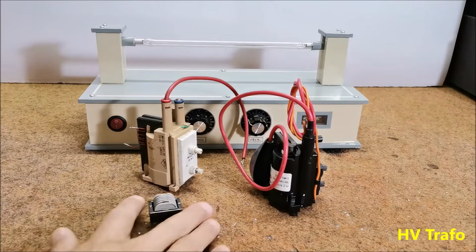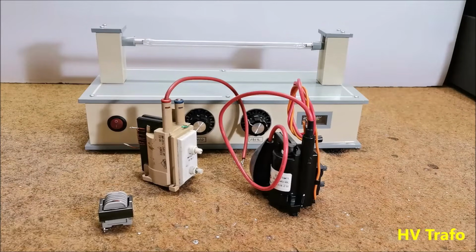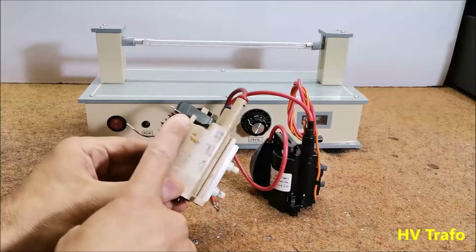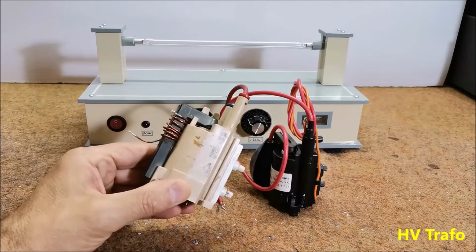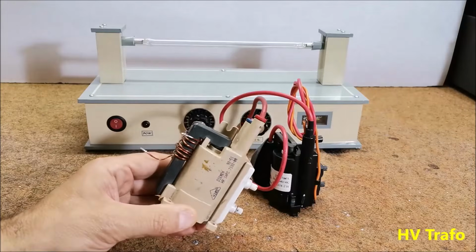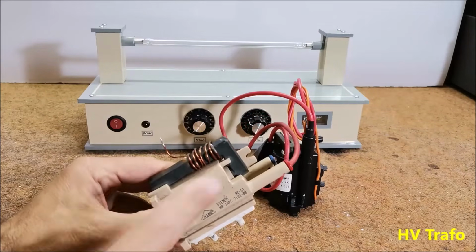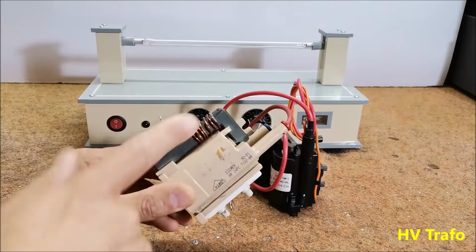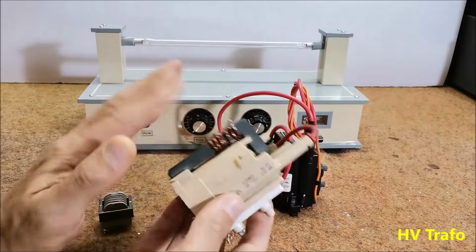If we use a high voltage transformer from an old monitor or TV, we need to wind about 7 to 10 turns of lacquered copper wire with a diameter of 1 to 1.5 millimeters on the core of the transformer. That will be the primary winding of the transformer.